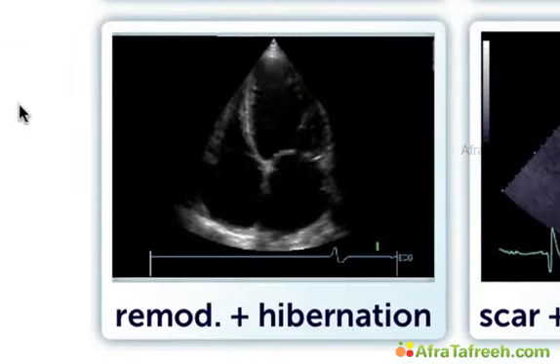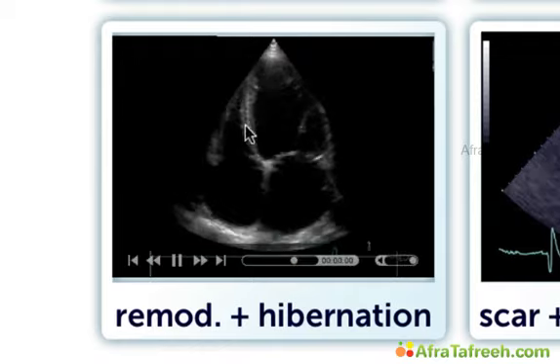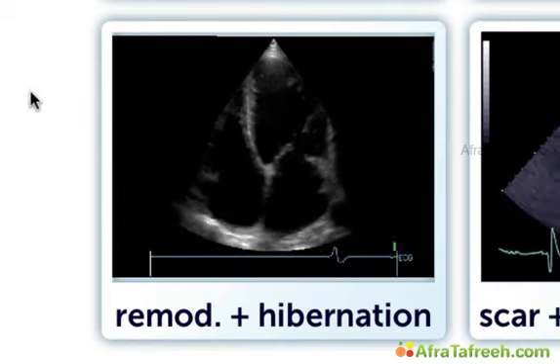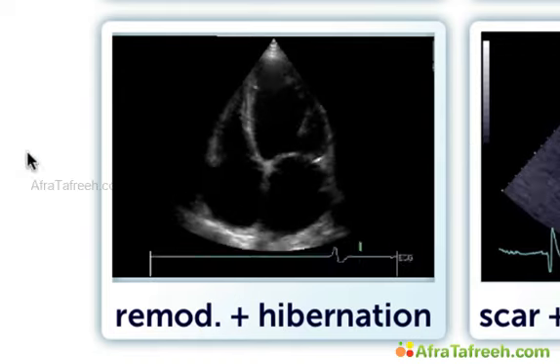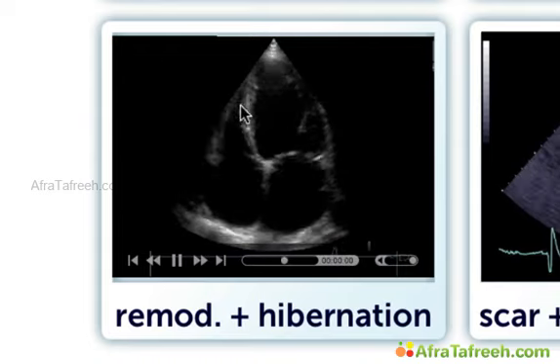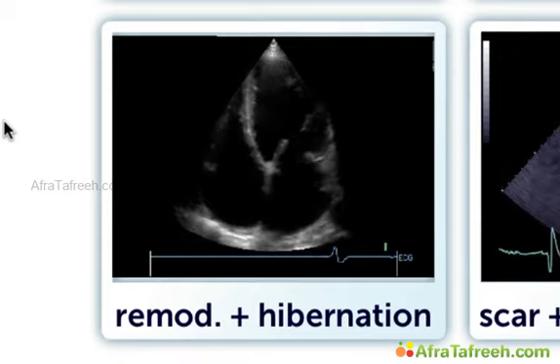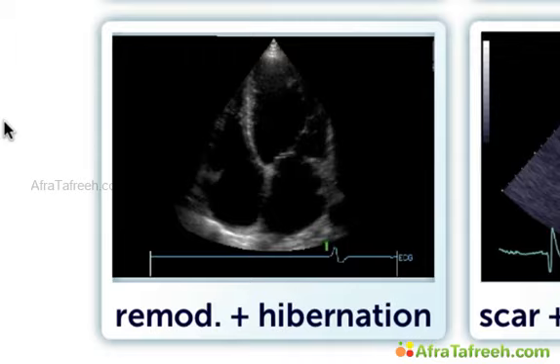This patient here had acute coronary syndrome many years ago, but now he presented with dyspnea. Taking a look at the echocardiogram, you will note that the patient has a severely reduced left ventricular function, that the patient has regional wall motion abnormalities, but the function is more diffusely reduced. But interestingly, we can find a normal thickness of the septum. So there is suspicion that the patient has some form of residual myocardial function viability, and that was documented with other tests, and the patient eventually ended up having coronary bypass surgery, and he benefited significantly. Ventricular function improved after the procedure.